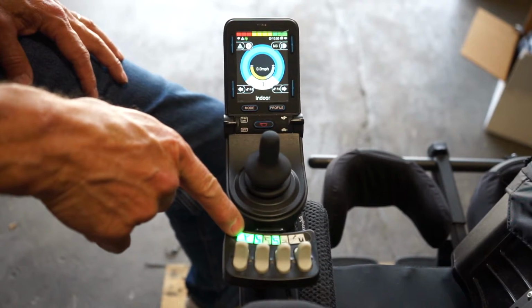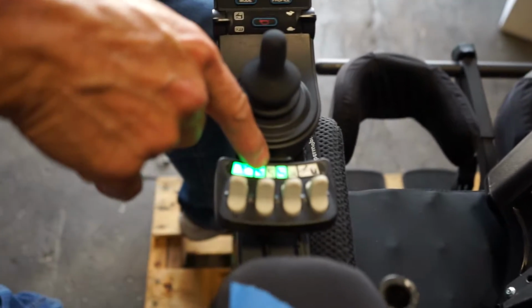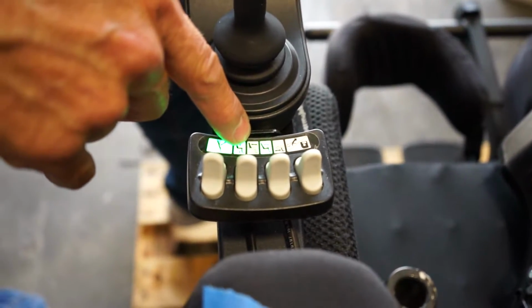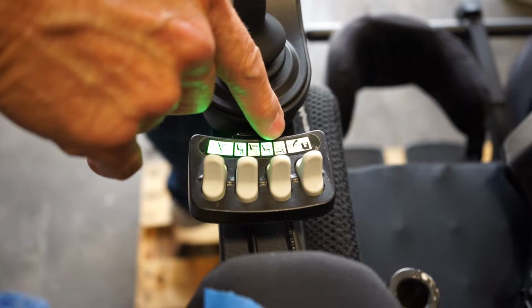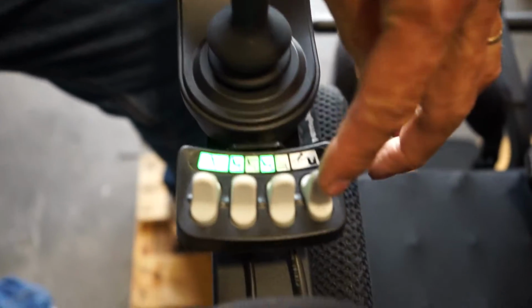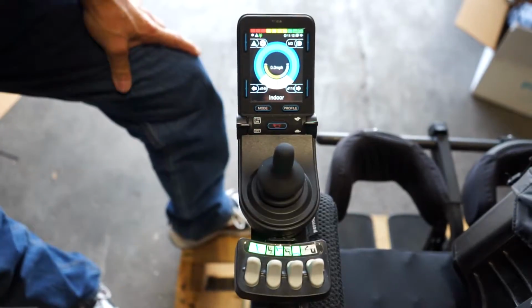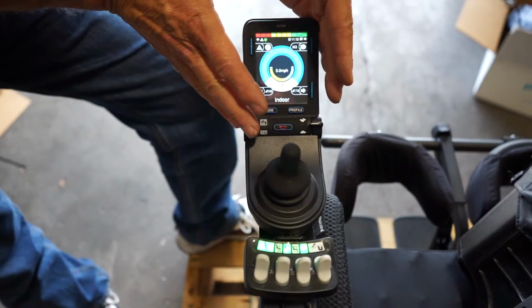The first button is standing. The second button is the seat lift. The third button right here, which is not green, is the recline, and the fourth button is the legs. They're not green. If you want to switch these options, all you have to do is click the last button right here. It'll switch the color. So again, when you work these buttons, you can work everything through the joystick over here.